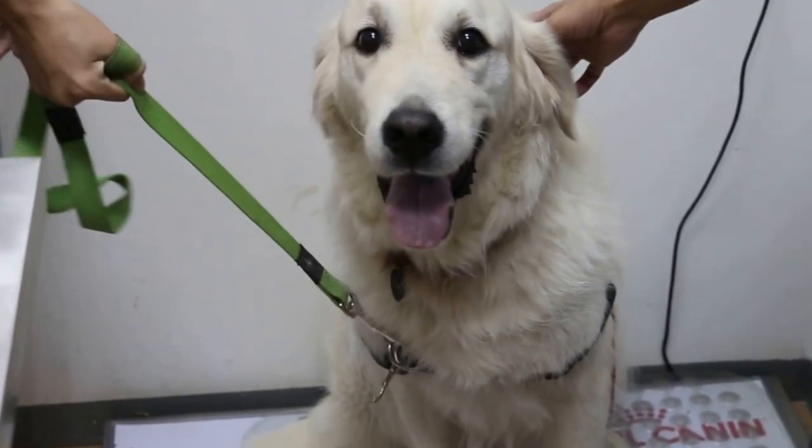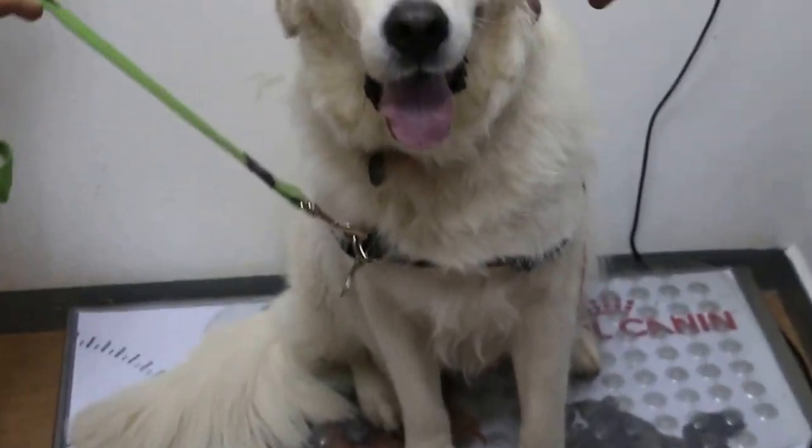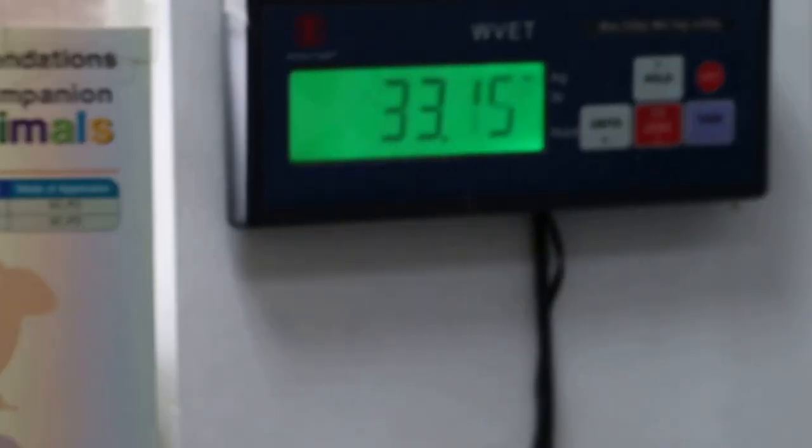This golden retriever comes in for vaccination. Before vaccination, we do the weighing first. So we record the weight. Zoom in, we record the weight.